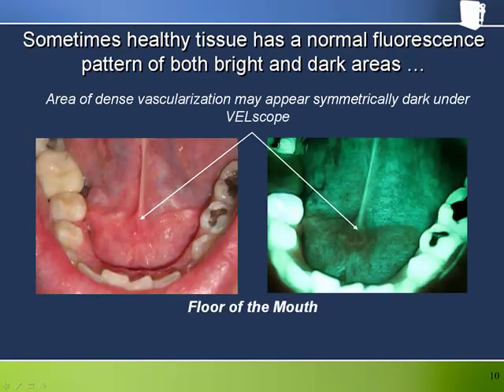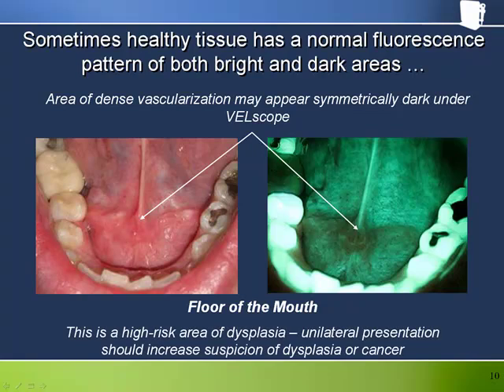This is a Velscope picture of the floor of the mouth and the corresponding area under white light illumination. The ventral surface of the tongue is also partially visible at the back. We see the theme of blood's role as a strong absorber in fluorescence visualization. The area around the sublingual gland can be well vascularized, and is particularly so in this example, showing up as a symmetrically dark area under Velscope.